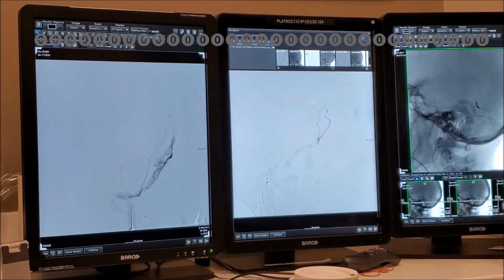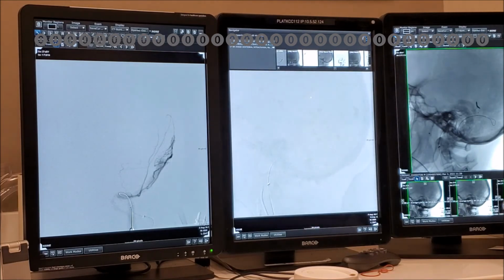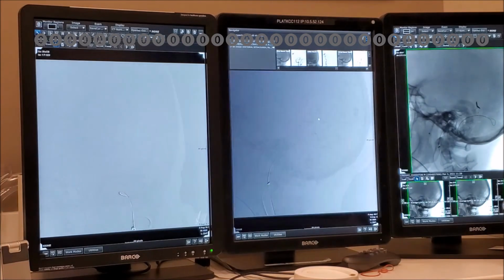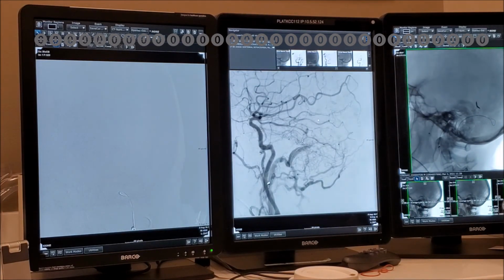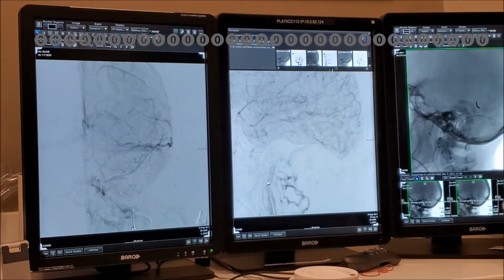So this is when you went in for that branch. So that's with the Septa all the way in that tiny branch. So we put a coil, I think 1x2 nano, to coil that branch off to prevent distal Onyx spread. And that was our Septa position. Again, balloon reinflated to check the sinus was still protected. And this is the Onyx from the Septa 4x10.